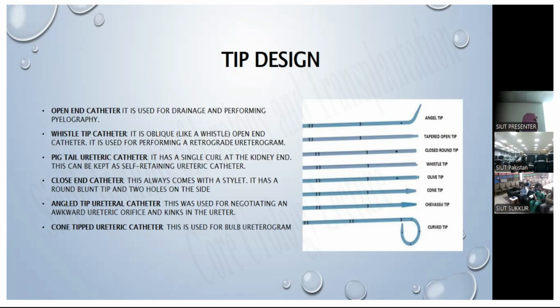So you see, there are many gadgets in your hand, and when you are a surgeon and you are working on a patient, it depends how you design yourself. One is the design of the instrument, and the other is the design of your procedure. So how you design your procedure, what kind of instruments you want to use first, second, third, in order to achieve one goal.